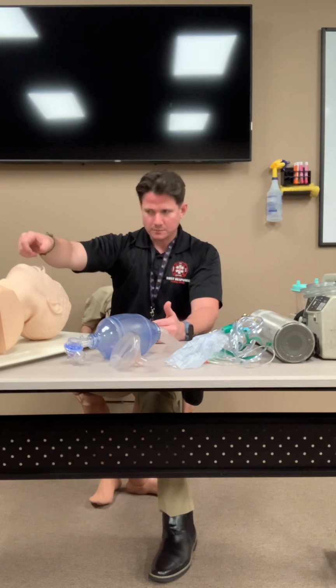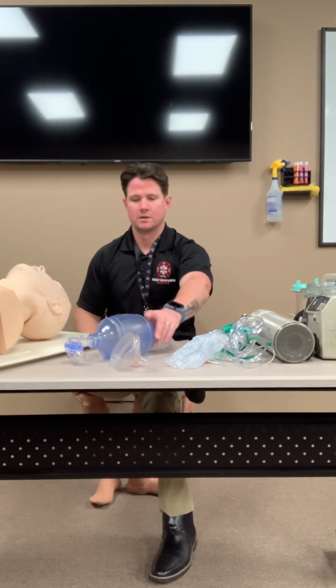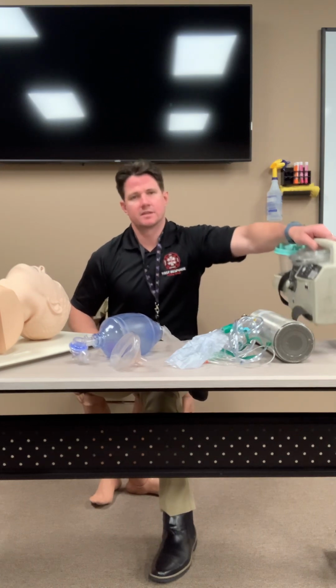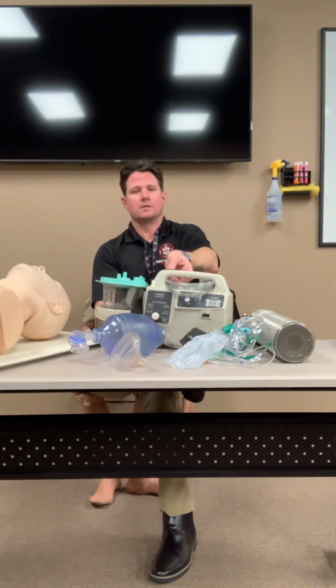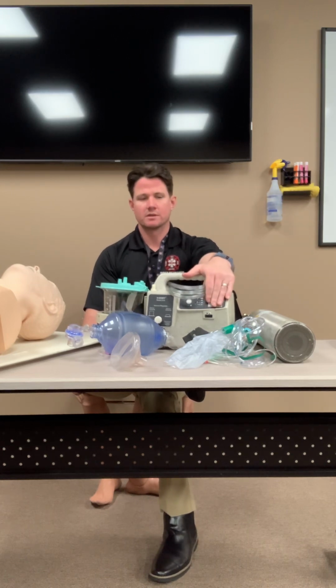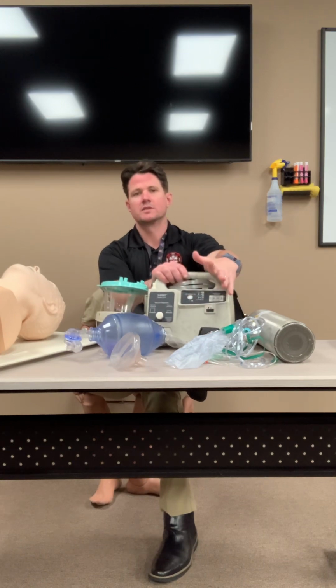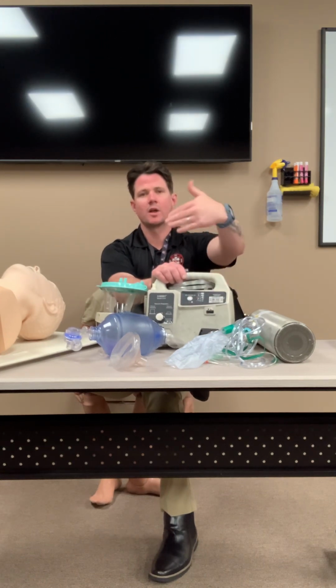All right, so next, this is probably the suction unit, right? Most of our suction units are like this unit. Our first step when we suction, right, is turning on the suction unit, right? The on button is right here. Obviously, it's not charged. We verbalize this. Remember, a lot of this is verbalization.